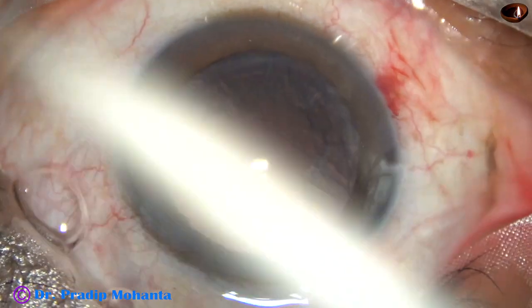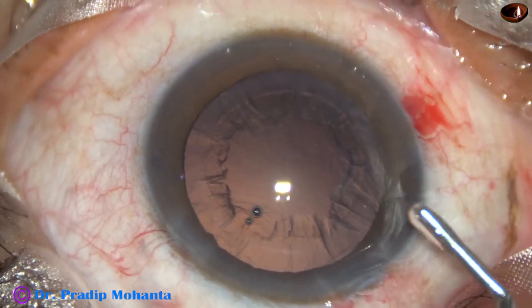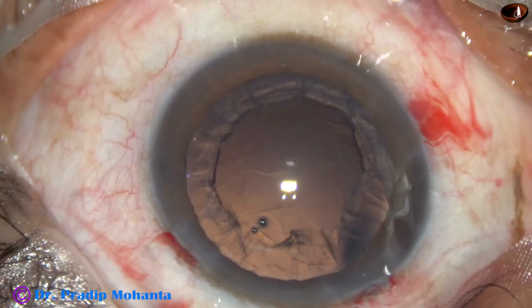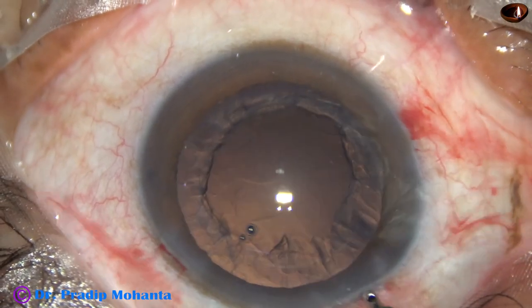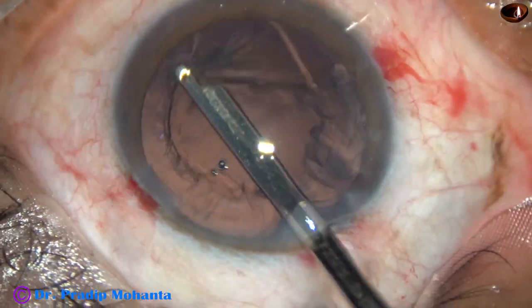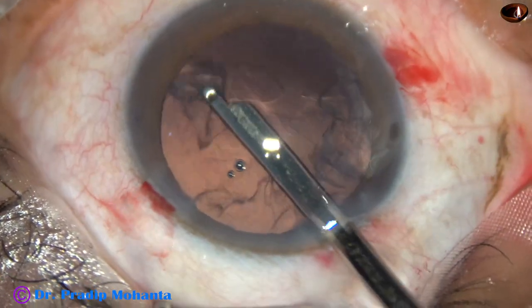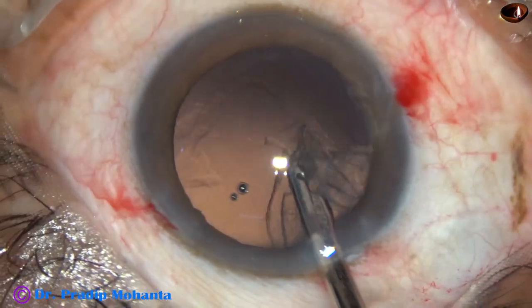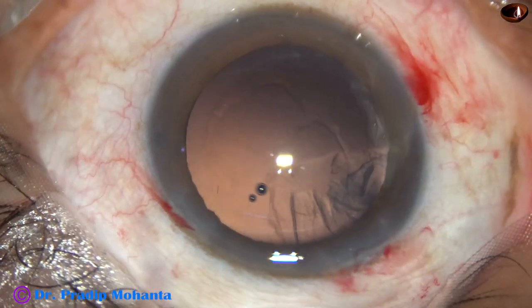Cortical cleanup is to be done now. I inject some visco because the anterior chamber remains formed for some time if we inject visco, and in that time I can remove a lot of cortex with the Simcoe through the main incision, and only a little bit remains in the sub-incisional area.